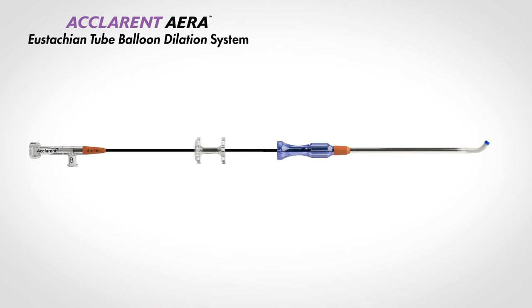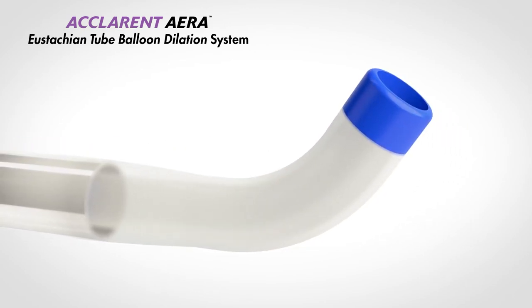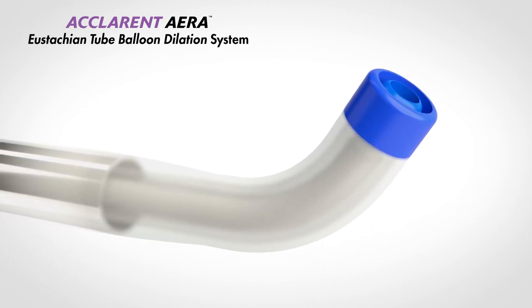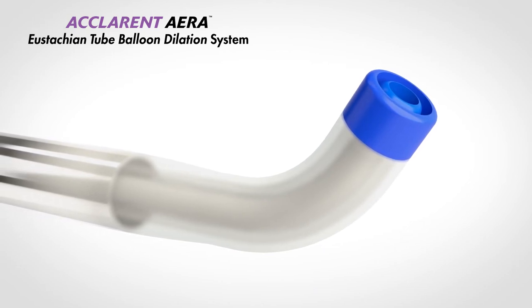The Aclaret Era includes a balloon and a guide catheter. The balloon catheter contains an actuator for advancing and retracting the balloon catheter. The guide catheter provides an angle near the tip with a trajectory for the balloon catheter to pass through and access the eustachian tube. The guide's distal tip is atraumatic and colored for endoscopic visualization.